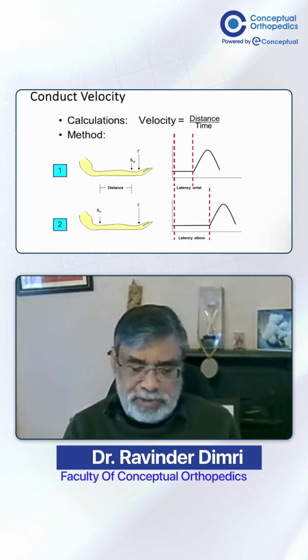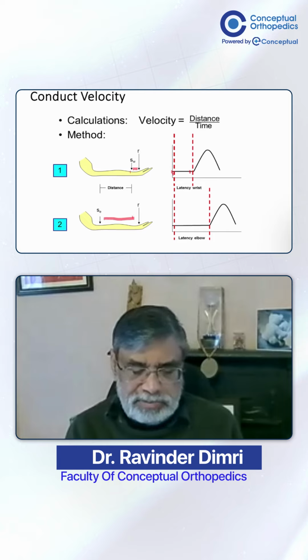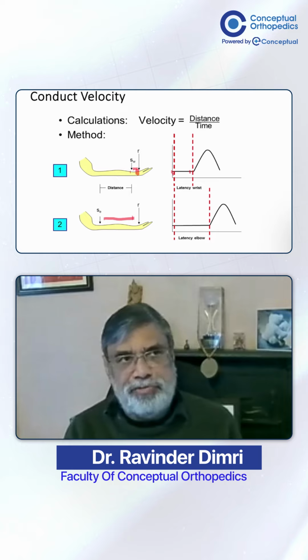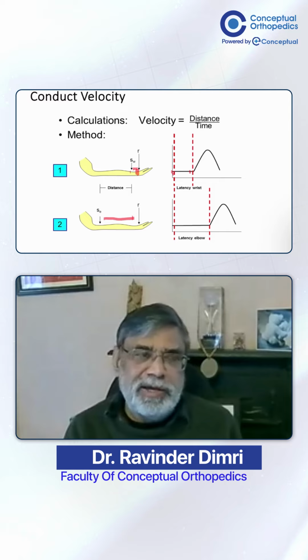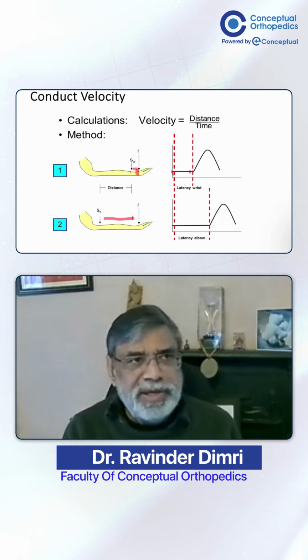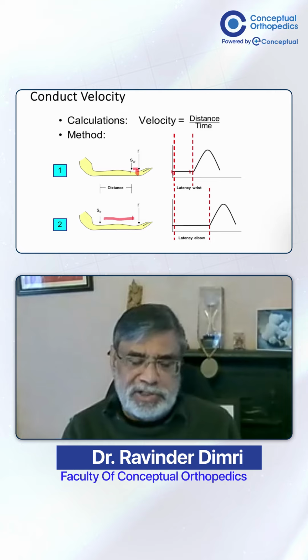You can measure from the time of stimulation, when the current started, when the voltage or the potential started, and this is called latency. So latency can depend on where you're stimulating. If you're stimulating at the wrist, latency will be small. If you're stimulating at the elbow, latency will be bigger. If there's a compression or injury, then latency will increase. So if you know the latency before operation, you know the latency from point A to B. And then during the operation, if this latency increases, then you know there's an injury in the spinal cord.